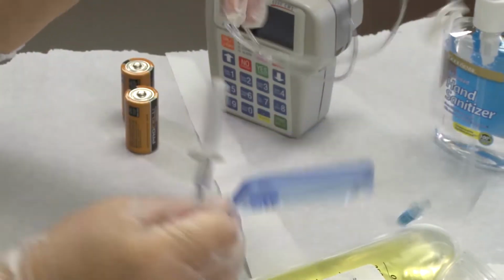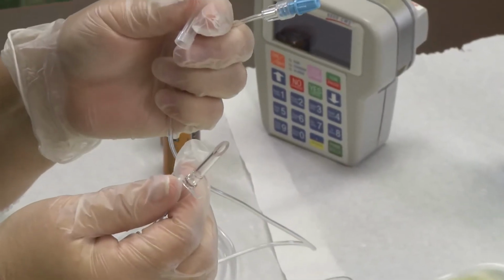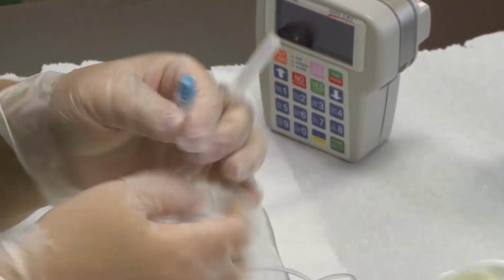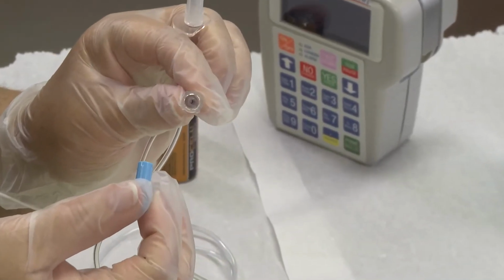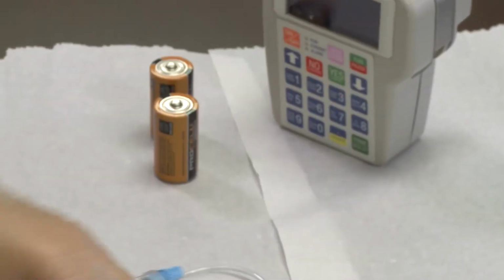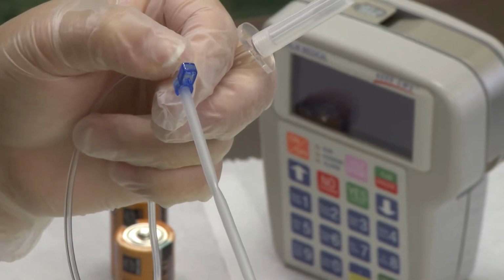It's all wrapped up. It has two ends. One end has a sharp spike that's going to go into the bag of TPN. The other end has what we call a luer lock that'll easily screw onto the end of your IV. And then on the tubing itself, you're going to see a yellow and a blue piece. These are the two pieces that we're going to have to fit into the pump.